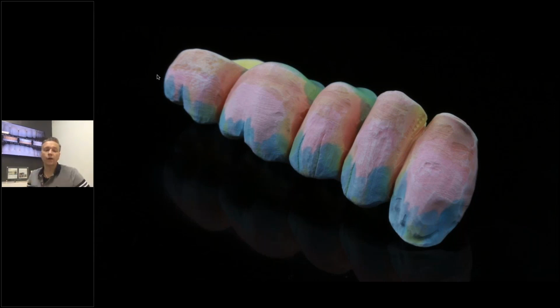If 20% orange. Yeah, so I utilize the orange very, very rarely, just a little bit. And as Richard mentioned, I use 20% orange and 80% dim liquid because the orange is so aggressive. Same with the gray. I use around 30% gray, 70% dim liquid. That's what I usually do. For the other regular colors, dentin and incisals, I use them pure. I do not dim them down at all. So violet and dentins are pure liquid.